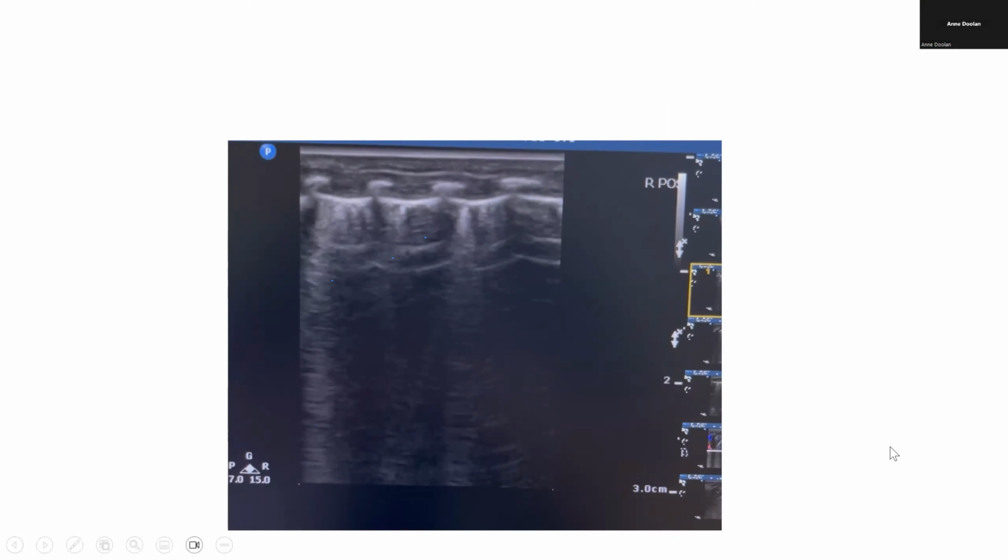Was the CRP elevated? Yes, it was 101. So clinically correlating, and that's where I'd say you're absolutely dealing with it. Unfortunately, for reasons of confidentiality, I can't share the case with you, but just to give you an example, I've had a 24-weeker present exactly like you, going from air to 30%, with a very similar appearance.